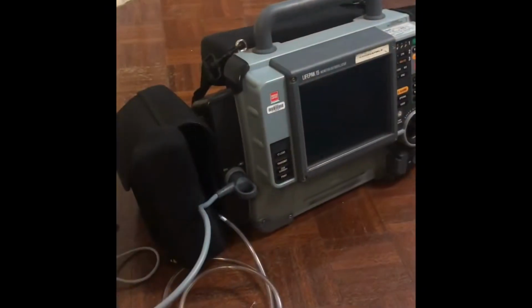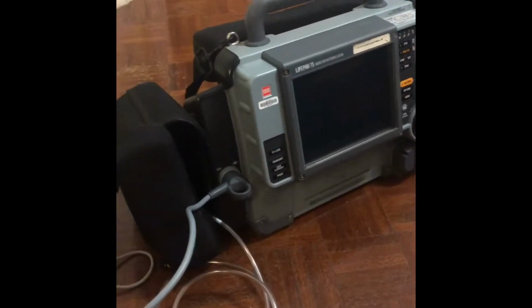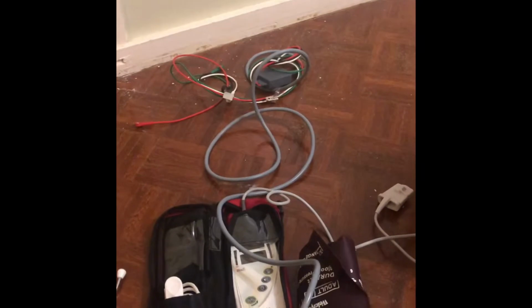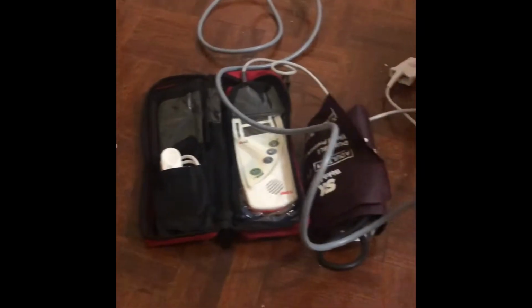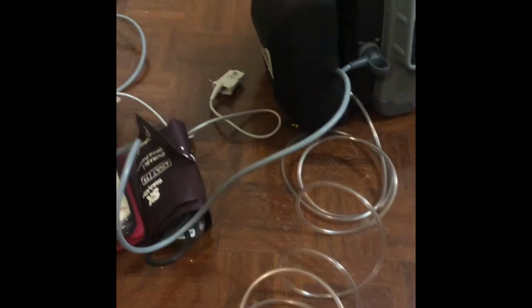At the start of planning for an RSI, we're going to have all the monitoring equipment ready. Here we have cardiac monitor, we'll have the leads attached to the patient, pulse oximetry, blood pressure, end-tidal CO2 monitoring, mainstream, side stream, whatever you have available. We're going to want to then pre-oxygenate the patient.